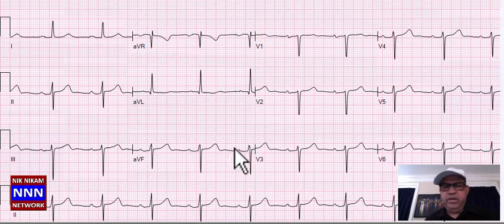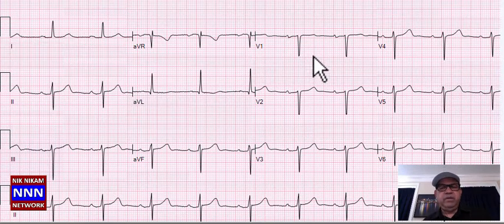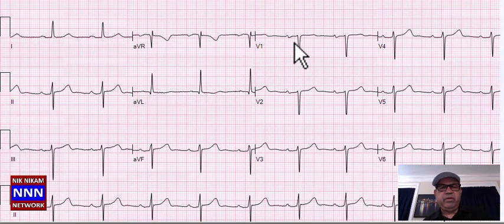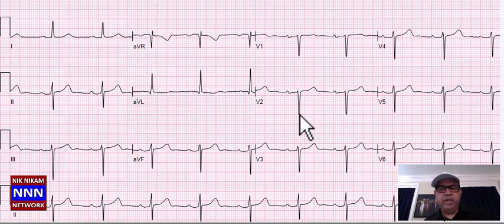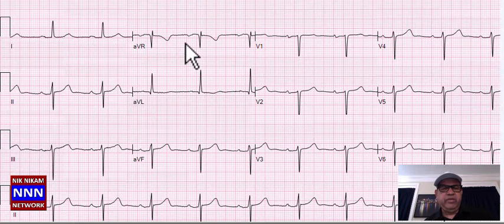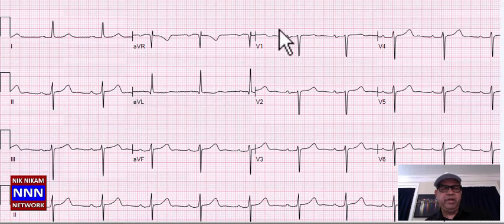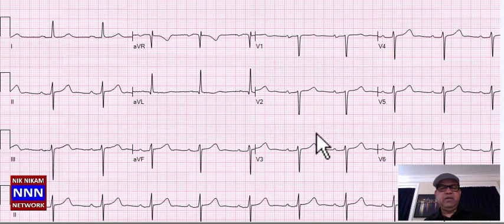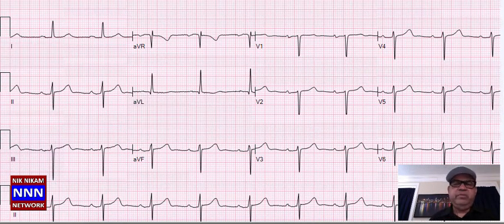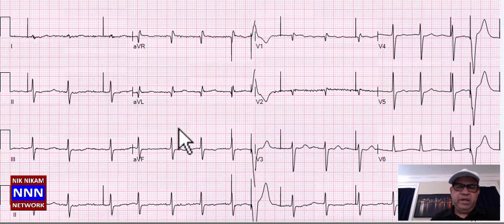We have sinus rhythm with perhaps left axis deviation and first degree AV block because of prolonged PR interval. Loss of R-waves anteriorly may represent old anteroseptal myocardial infarction but nothing really acute. So we have sinus rhythm, left anterior hemiblock, first degree AV block, and possible old anteroseptal MI.